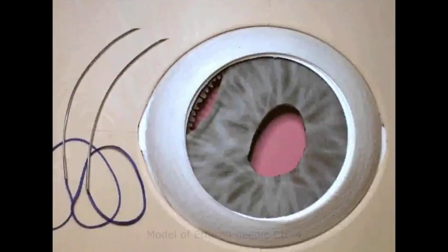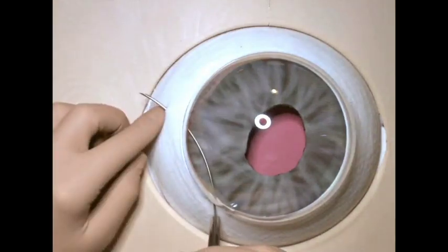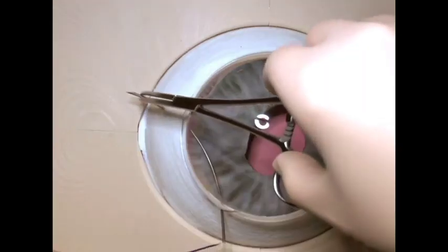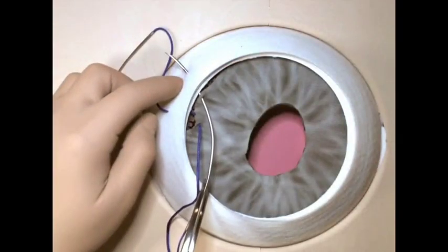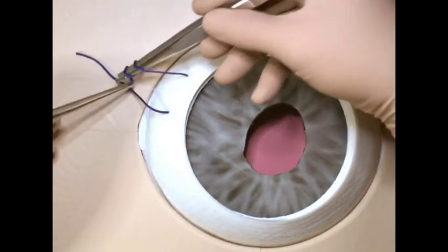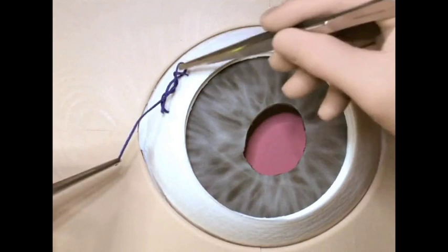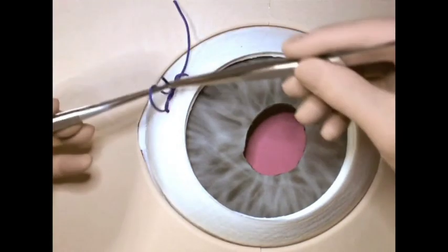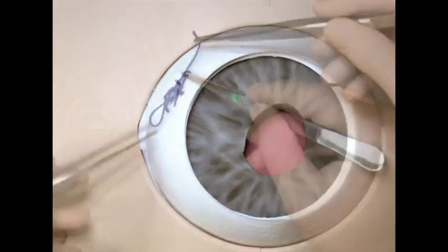The most simple solution to iridodialysis is a suture passed through the sclera under the conjunctiva. The knot has to be buried.